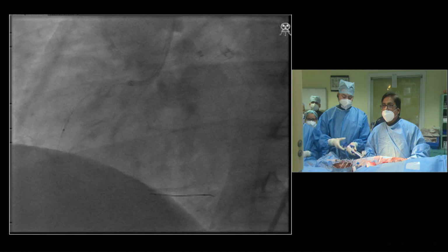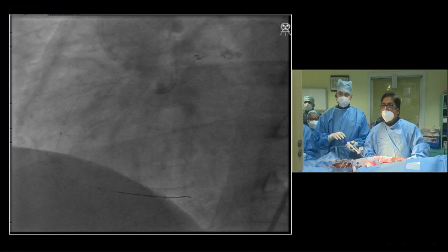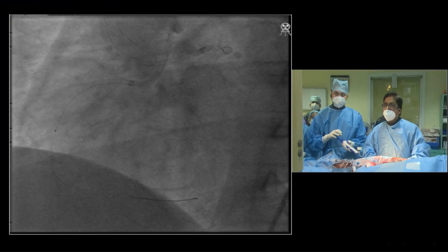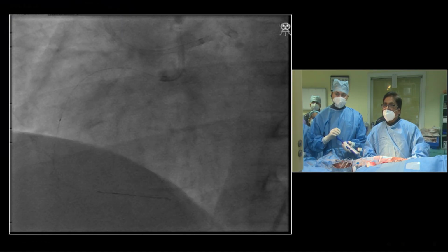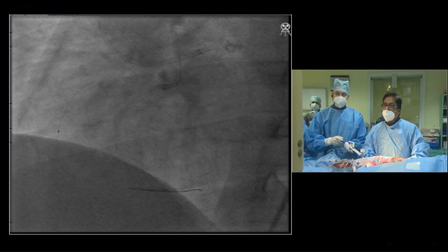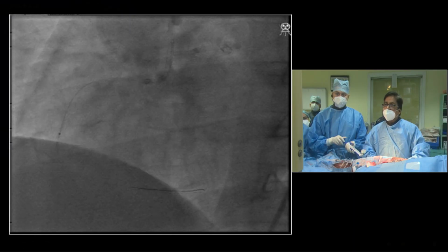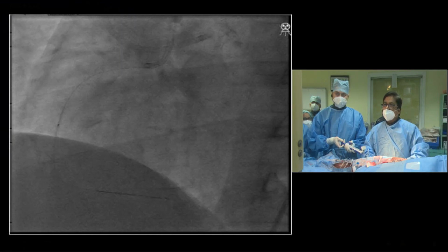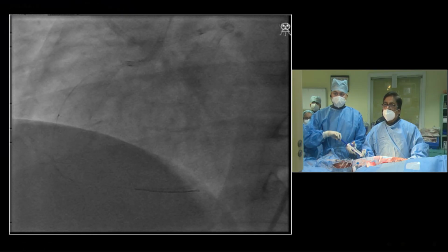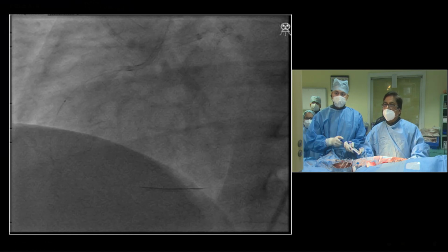Down, please. In a live case, we should not. Actually, our catheter is backing out, sir. No, I'm controlling it. Okay. Balloon inflation, please. I think now if you want, you can keep an anchor wire, not even a balloon, but one more wire in the distal vessel or in the side branch, so that your catheter will be more stabilized. You could probably use a guideliner also, to get a bit more support.